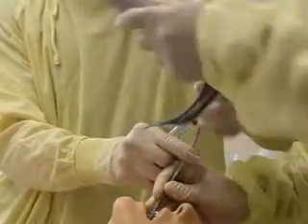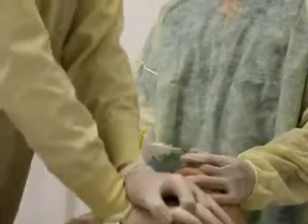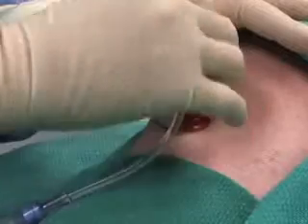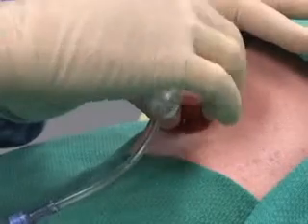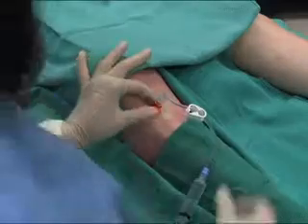Obtaining rapid vascular access is an essential step in the resuscitation of critically ill patients. The intraosseous route provides vascular access quickly and reliably when peripheral and central venous routes are unavailable or have failed.